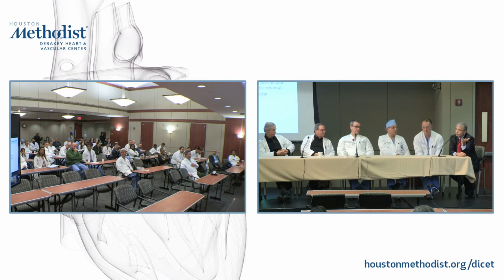It's tougher to quantitate the regurgitation, particularly if you have a mixed regurgitation, aortic and mitral. And even, I'll share that with people who are listening, where do you quantitate the left ventricular outflow tract flow? And what cross-sectional area do you use when you have a prosthesis that is migrating down in the LV outflow tract? So it tells you about the issue.